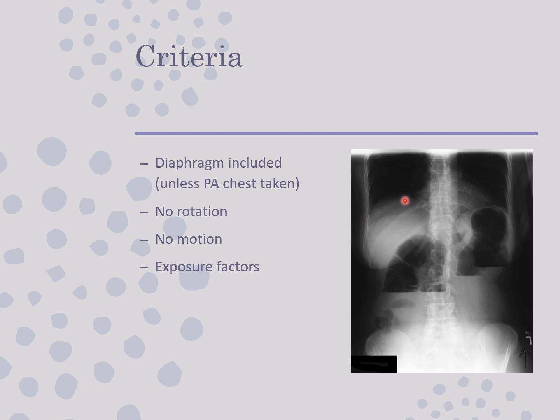You can see we've got diaphragm on here. You can see that those are loops of bowel, and we know that the patient was standing up or erect because of this solid line that we see, and air is rising. We also use a left marker on all of these if at all possible, unless it's a left lateral decube, which would force us to use the right marker.